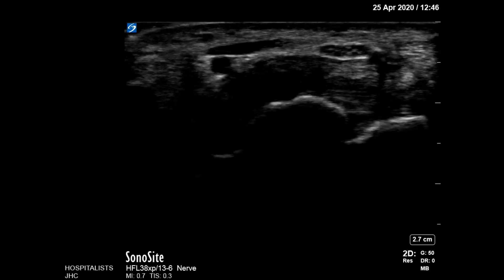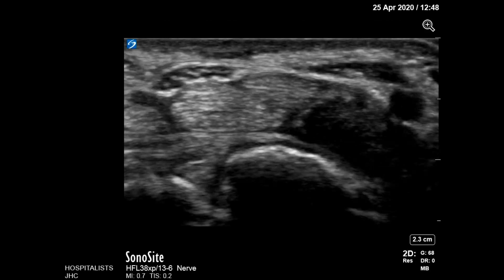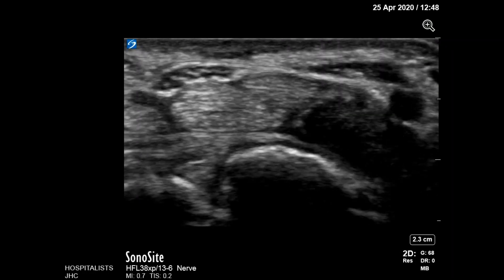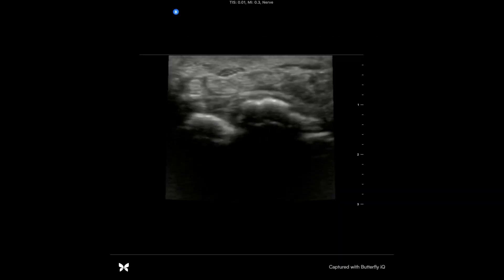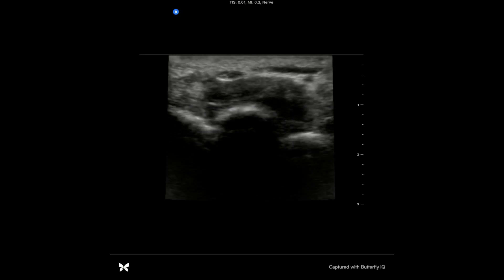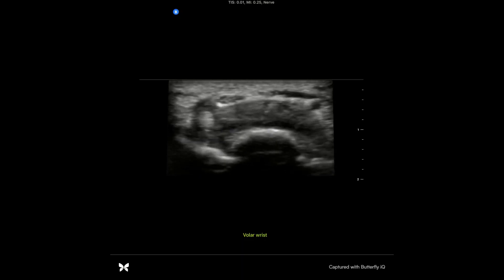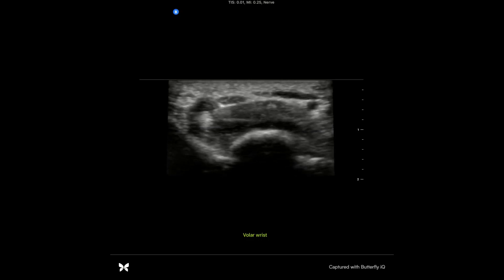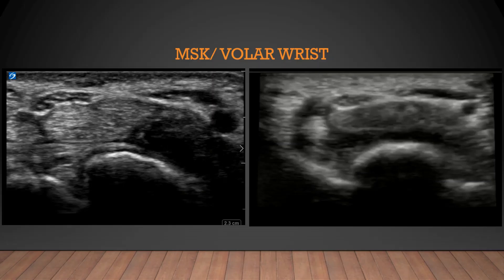On the question of near-field resolution, here we're looking at the median nerve — that dotted structure just to the left, about four to five millimeters underneath the surface — with the ulnar artery pulsing off to the right of the screen. Here's the same site with the Butterfly. I can see the median nerve four to five millimeters deep in the center of the screen. The whole thing is a little less crisp, a little blurrier, but I can see all the structures I need to, and I would have no problem doing a guided median nerve injection with this image.